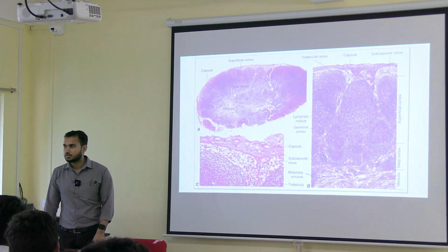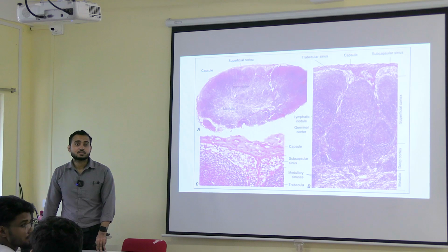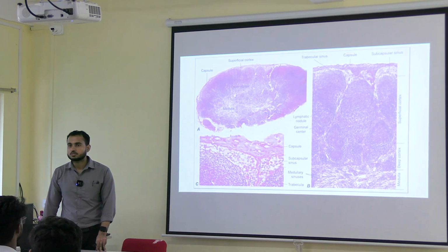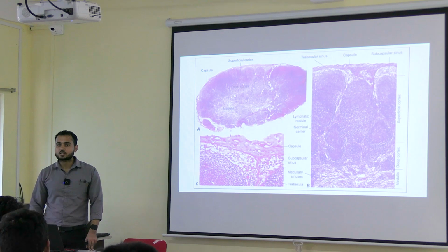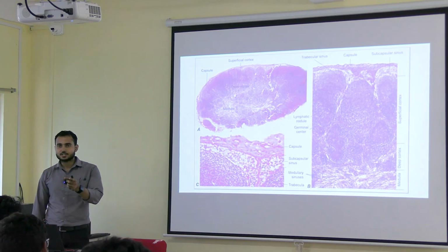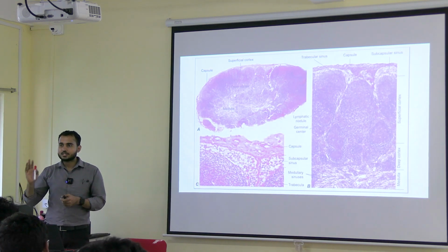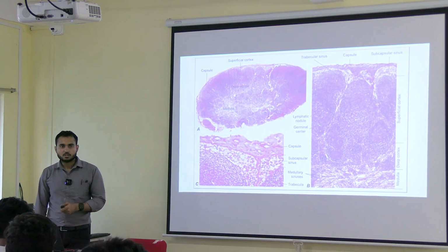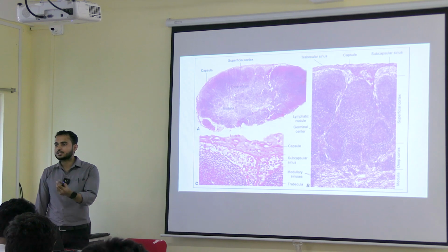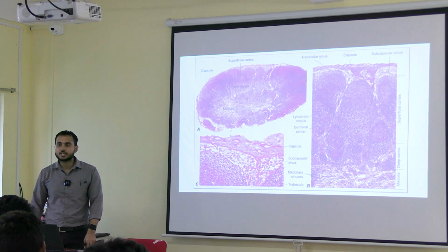Have you seen the thymus? No. That is the reason. It degenerates. Okay, the thymus just after birth, the size starts increasing up to puberty. It reaches its maximum size, and after that it starts degenerating. Okay, and then you will be getting thymus as adipose tissue. ठीक है, इसीलिए जब डिसेक्शन किया थाइमस दिखाई नहीं दिया.